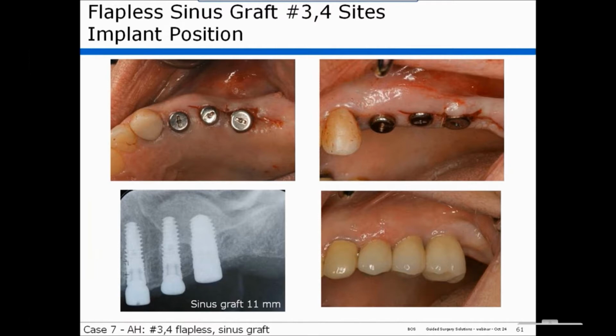Or, as I said, in a given case, it's possible that you could have the bicuspids with tube guides and then the molar next to them, because of lack of vertical clearance, you would then use the thin layer guide for the molar. So we try to provide a lot of flexibility to handle most situations a surgeon would run into.